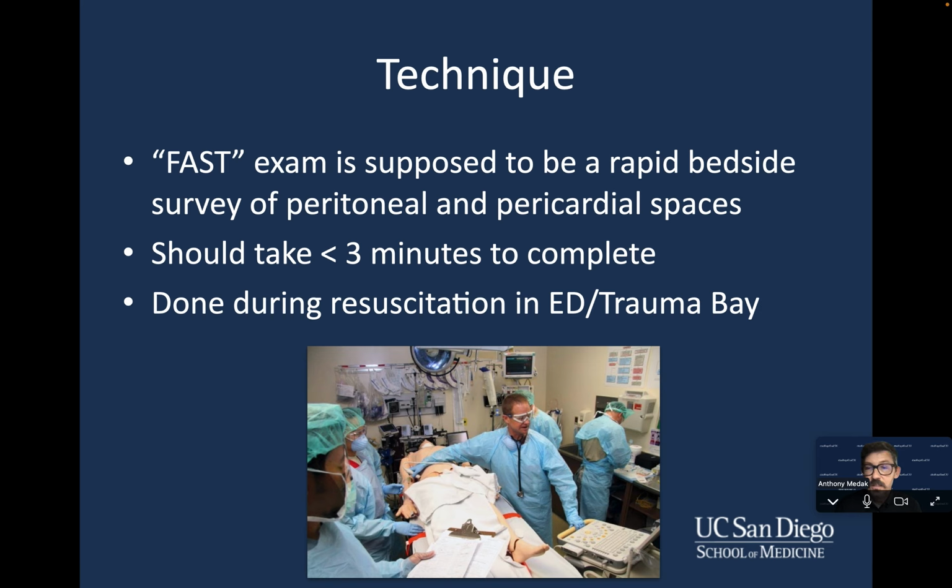Generally, it's done at the bedside in the emergency department or in the trauma bay. But to be totally honest, in some EMS systems, for example, this can be done in the field. This can be done in a helicopter. This can be done on the beach. This can be done in a war zone. It really can be taken anywhere because these ultrasound systems are getting smaller and smaller.